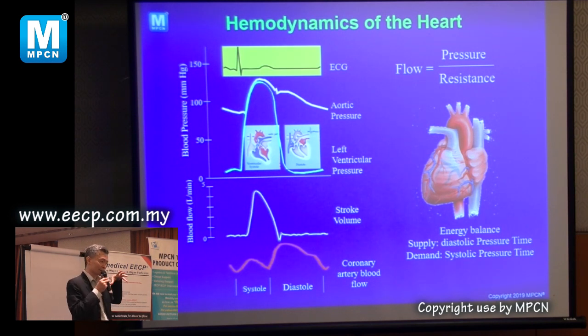Let's say the heart is contracting and the machine thinks the heart is relaxing, and it pushes. Then you have a conflict and fighting. If it's a normal heart, like young people coming just for wellness, no problem. But if you have a lousy heart, contracting against a resistance coming out to you, it can cause harm because you increase the work. The heart has to work very hard.